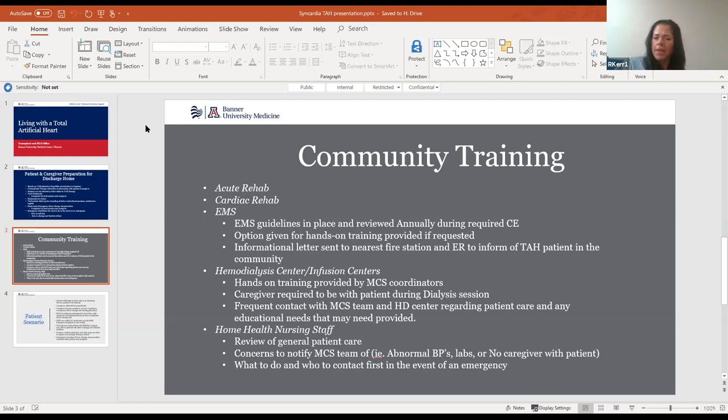We haven't had a home health nurse, and I don't know if we've trained them for doing an actual driver change out. We would have them call 911 and we would walk the fire department through it, unless there was a caregiver, of course; we'd use them first.